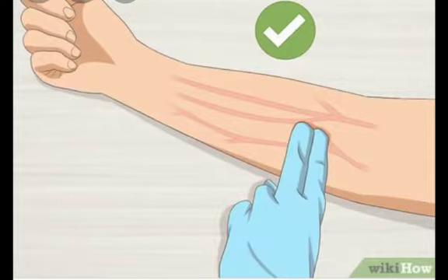You have to palpate the vein. When a vein is selected, cleanse the area with alcohol in a circular motion. Allow the area to air dry. After the area is cleansed, it should not be touched or palpated again. If you find it necessary to re-evaluate the site of palpation, the area needs to be re-cleansed before the venipuncture is performed. So the last step before venipuncture is the cleansing.